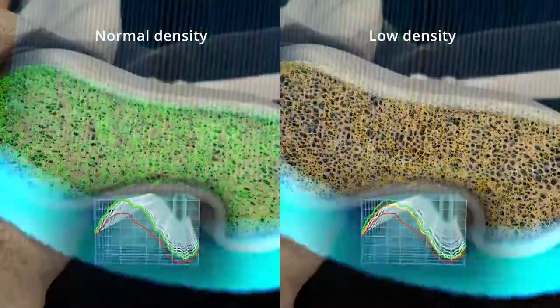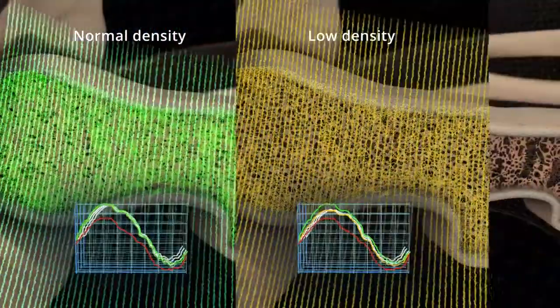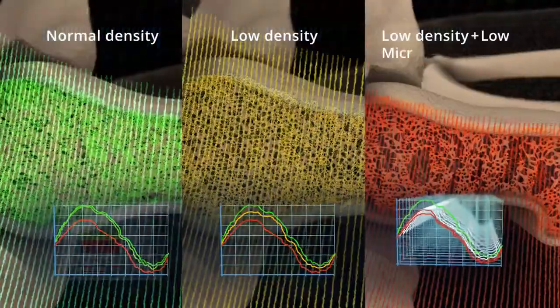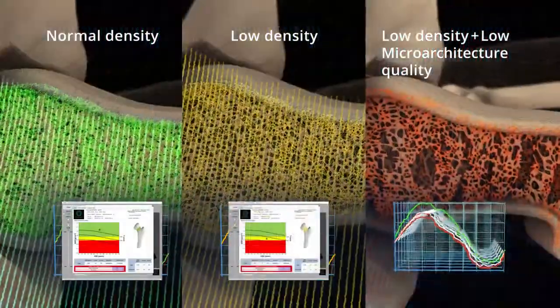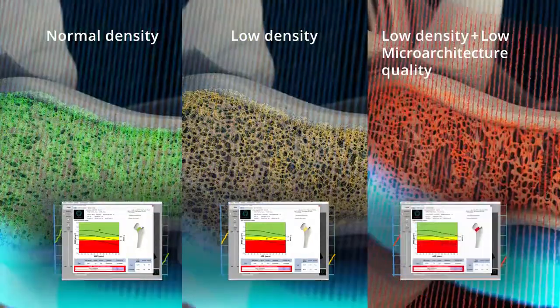Echos, with an easy and quick examination, quantitatively assesses the bone density and the quality of microarchitecture, providing an accurate estimation of the fracture risk.